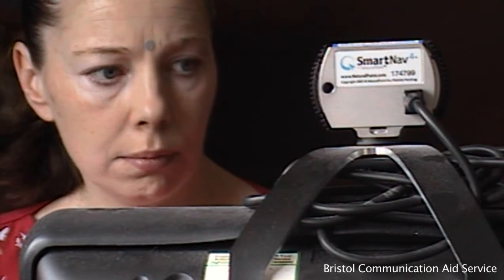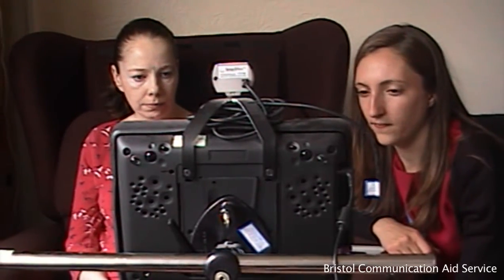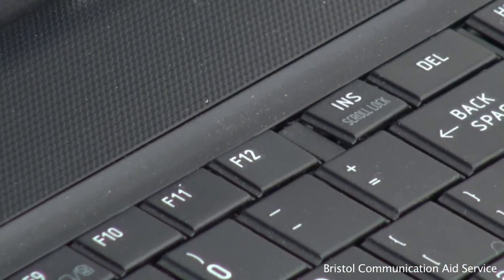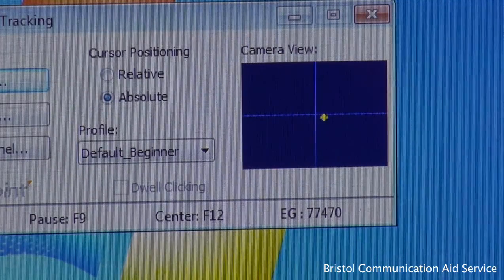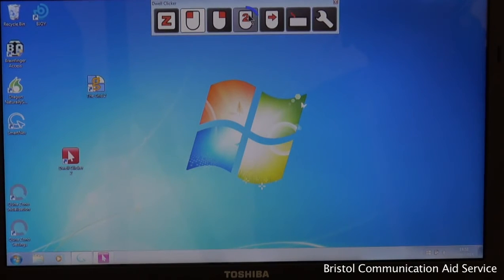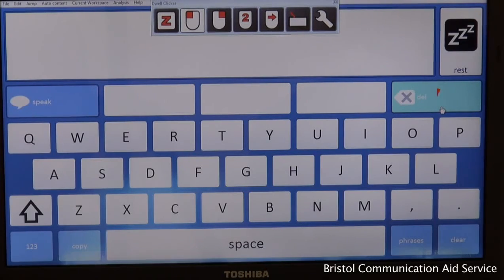To access Dwell Clicker 2, first ensure the sticker is on, the user is sitting comfortably for appropriate calibration, and the sensor is set up. Select the Dwell Clicker icon, then press F12 to recenter the cursor while the user focuses on the center screen. Alternatively, if relative is selected instead of absolute, scanning the head from side to side will allow the user to independently recenter the cursor. Dwell Clicker is great for enabling users to navigate the computer independently, including setting up Smart Nav calibration, adjusting their own settings, and using double click to open the grid and enter their communication program of choice. The grid, the user, and even Dwell Clicker can also be set up to open automatically on computer startup.